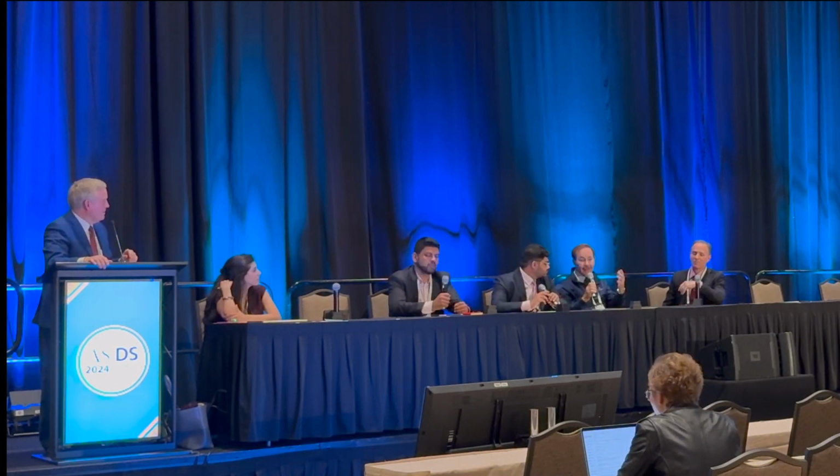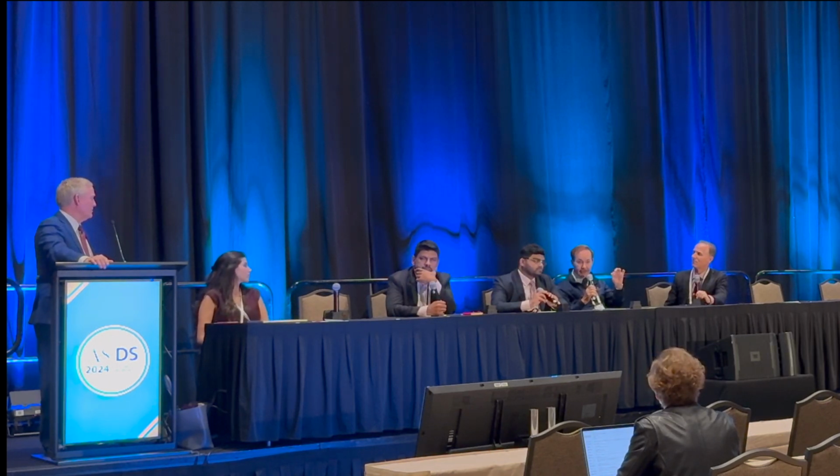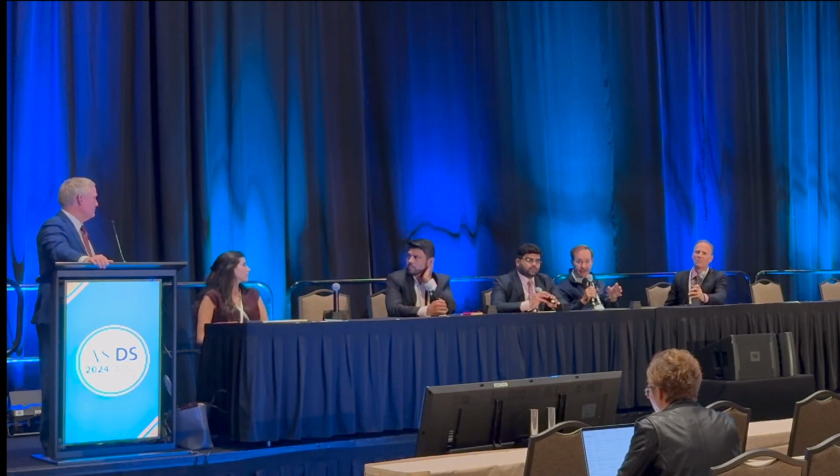Another comment is that using the CROSS technique gives you a smaller unit of injury. The smaller your ablative unit, the less risk of PIH. That's the strategy behind mixing CROSS with laser.